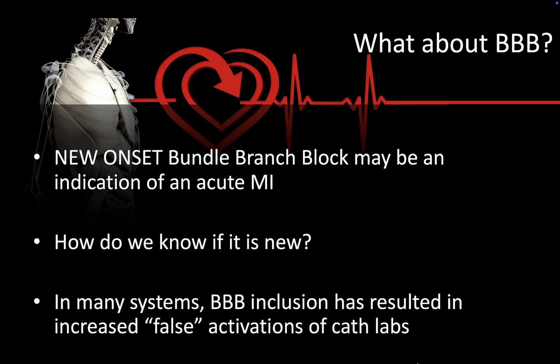But it's also responsible for a lot of false activations in systems where every bundle branch block goes to the cath lab, because we have a lot of patients walking around with bundle branch blocks that they may or may not be aware that they've had for some time, and not because of any acute event that would benefit from a trip to the cath lab.